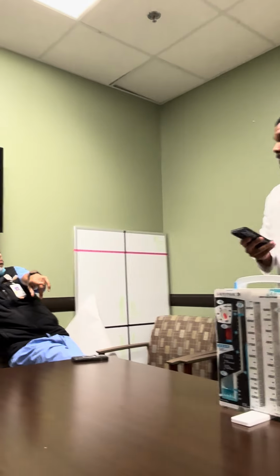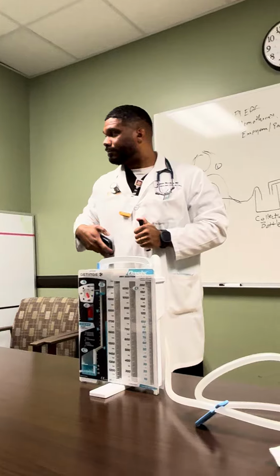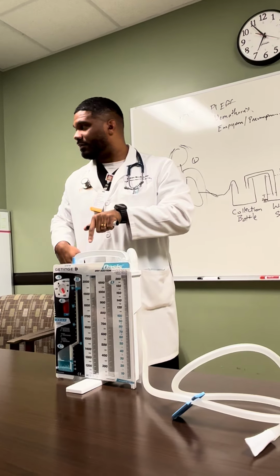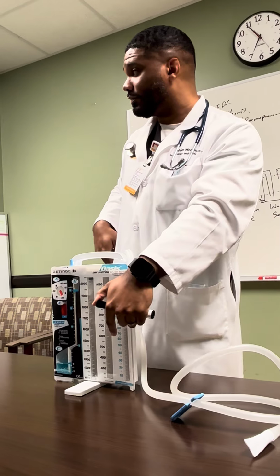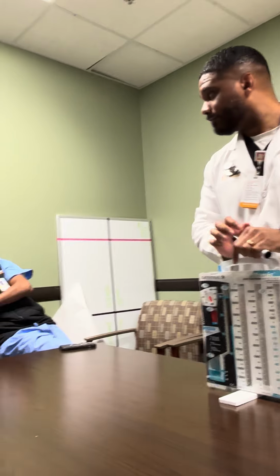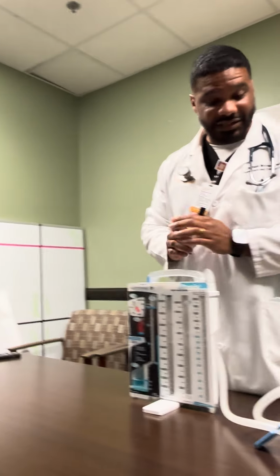Did you go over first steps in a patient in distress with a pneumothorax with a chest tube in place? First assessment, like the first thing to look for? Air leaks and whatnot? No. So, patient with a pneumothorax, chest tube in place, but in distress: look to see if the tube has been clamped. That's the other thing too.